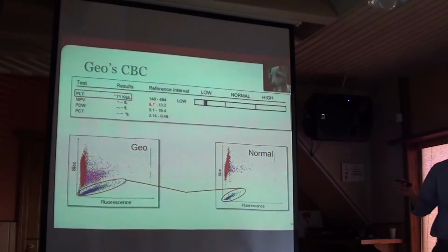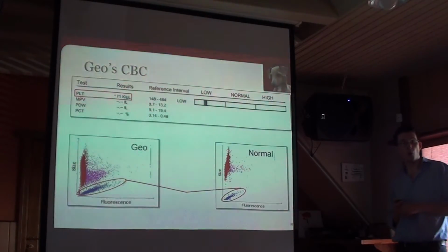So there are two things to notice. First, that the reported concentration is very low.